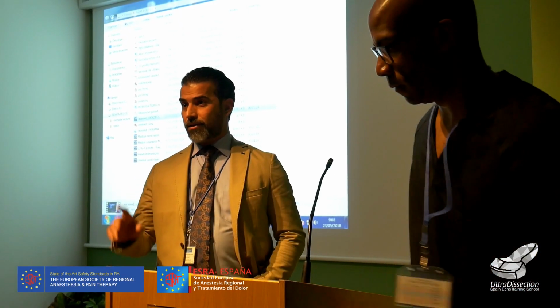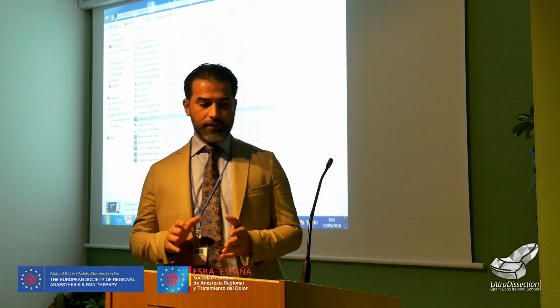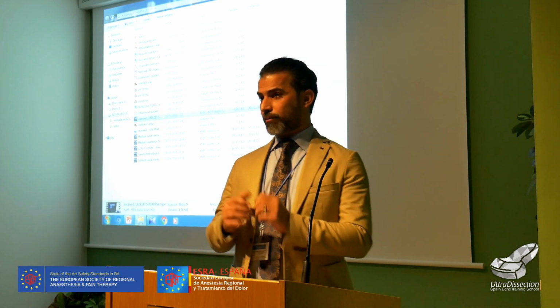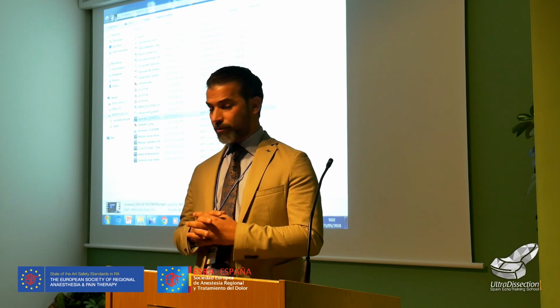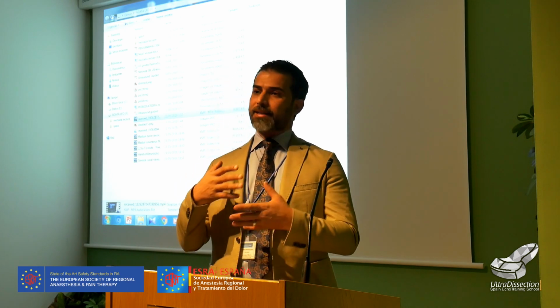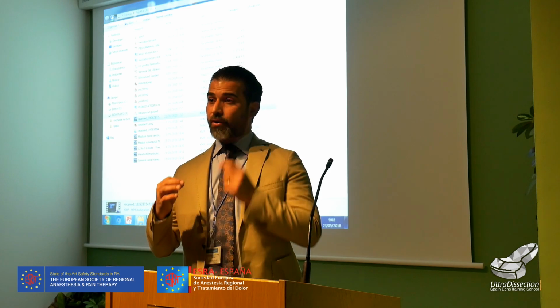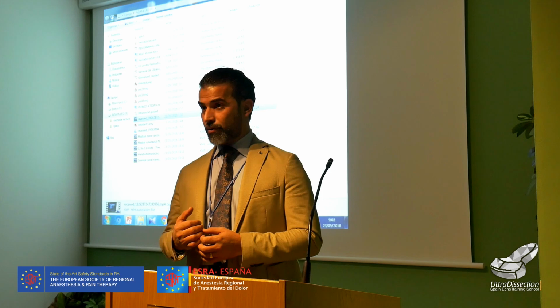Generally, in some cases or some interventions, for example, sacroiliac joint, I use the ultrasound with a curvilinear probe, I put the needle inside the sacroiliac joint after identification by ultrasound, and then confirm by fluoroscope. Because any target in between bone structures is very difficult to be sure you are inside by ultrasound. You need confirmation by the fluoroscope.